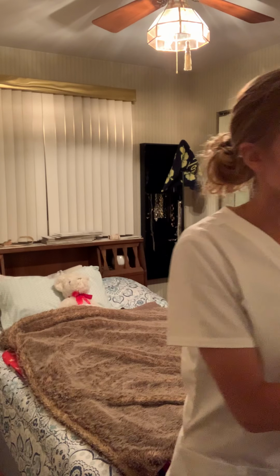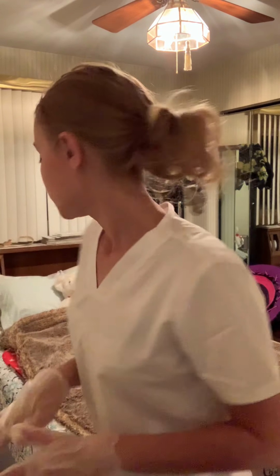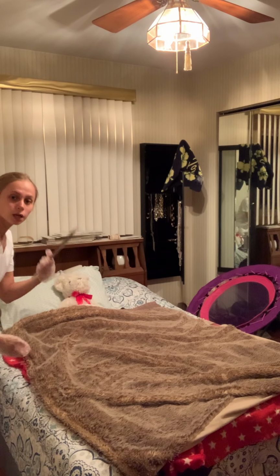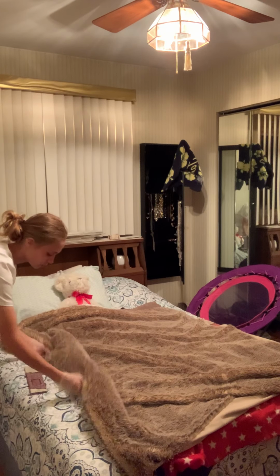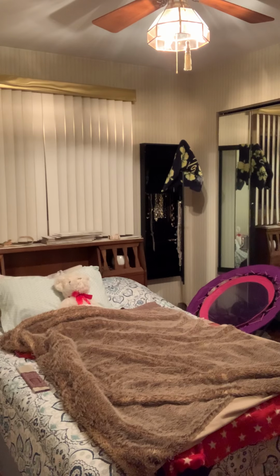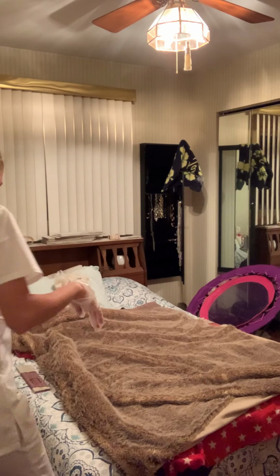For safety, we are to put the rails up, both of them. I am putting my patient's rail up, and then also on the other side. Then we are also going to make sure that the wheels are locked, because we don't want our patient to be rolling while we're making their bed. Locked the wheels.